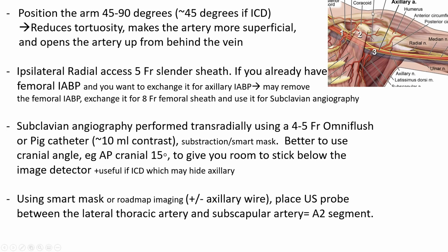We want to stick, and you don't want that image intensifier to be too close to the body. Remember, you want to stick in this area below the image intensifier. So it's nice to have the image intensifier a little bit higher than usual and to have it a little cranial. This way you have room to work while keeping roadmap imaging. So that's the reason I use cranial. Also, it's useful to have some cranial if you have an ICD to open the artery on top of the ICD. So it's not hidden by the ICD fluoroscopically.